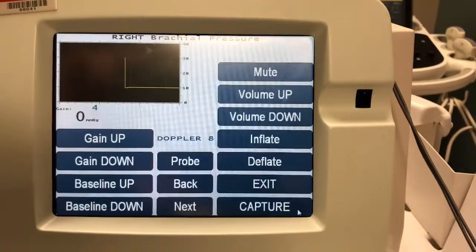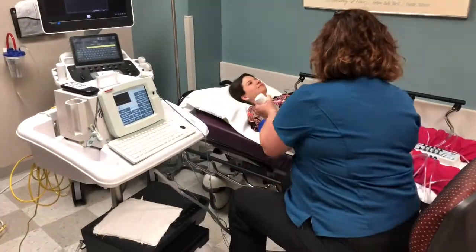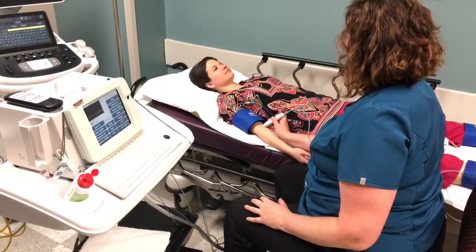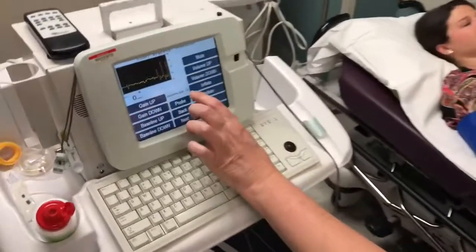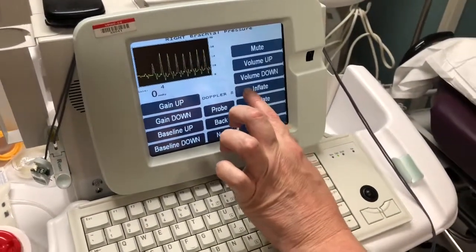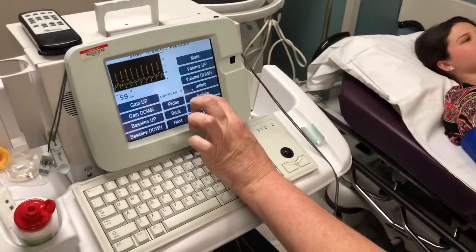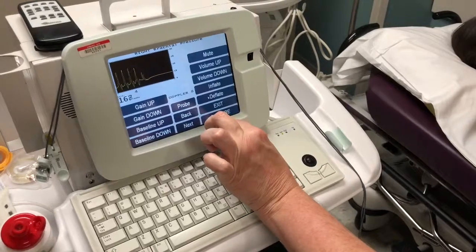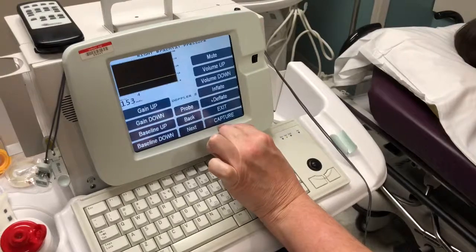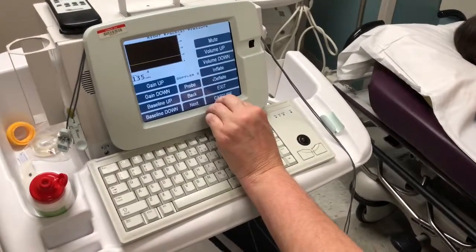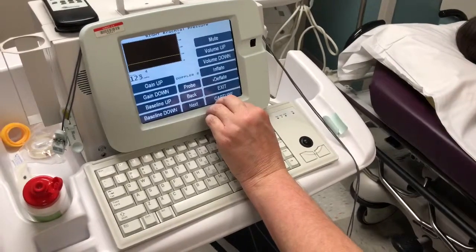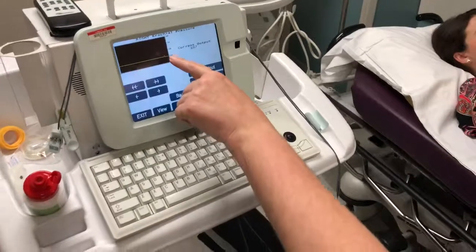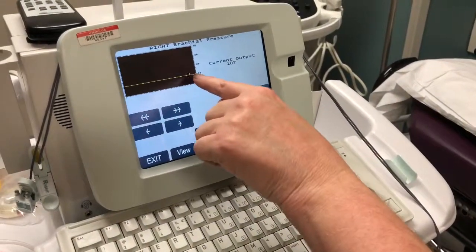Now it has us at the brachial pressure. I'm going to put some gel on the patient's brachial artery at the antecubital fossa. I'm on the brachial artery. I'm going to hit inflate. When the signal goes away, I will hit deflate. And then as the pulse comes back, you hit capture. I like where it is here, and I will hit next.